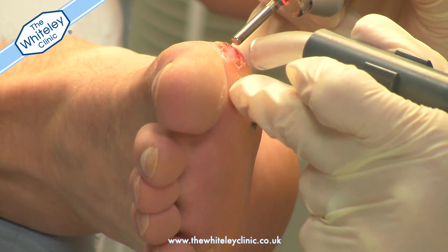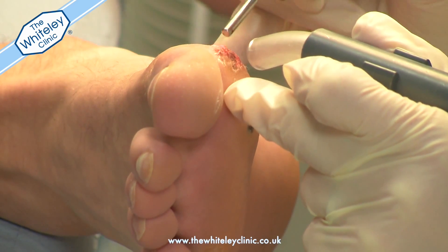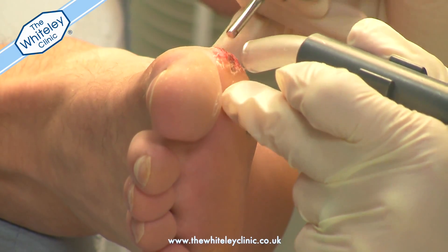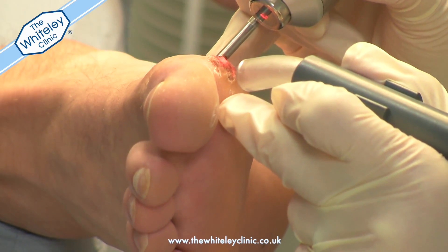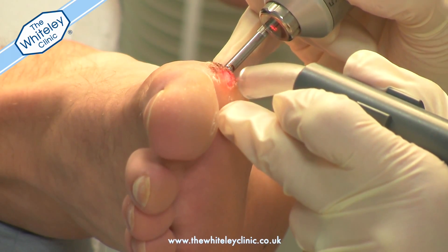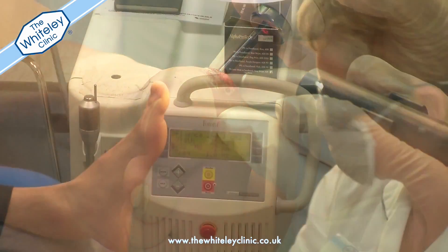This ensures that the whole area being treated is covered. During this time, the cryo machine is working in conjunction with the laser to keep the area cool and relatively pain free.